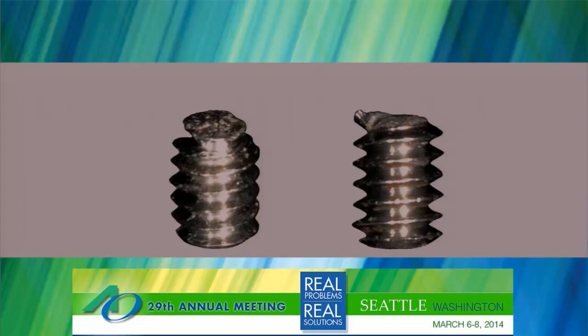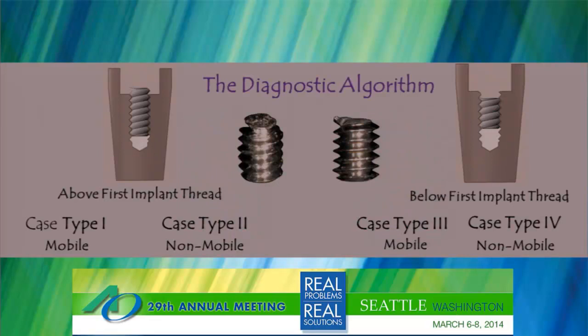So a lot of times when you look at this one sharp edge on the right-hand side and you put it into an implant that's fractured and is below the top implant thread, someone will think, well, it won't come up, so there's automatic thread damage on the case. Well, maybe not true, because if you happen to be the first one into this case, I can tell you that it's probably that sharp edge.